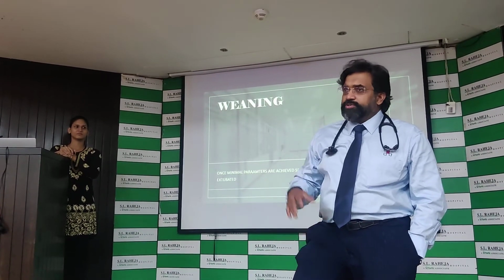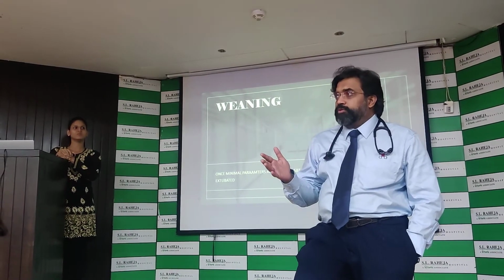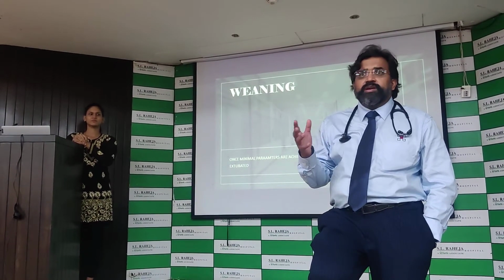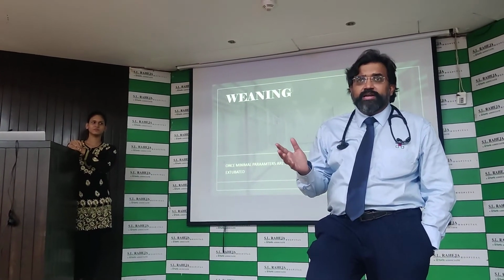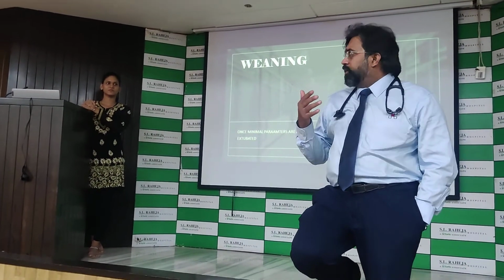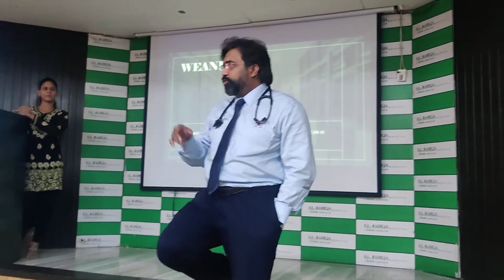To set the PEEP and the FiO2, this particular ventilator also has a PV curve, a PV tool. You can actually figure out what the optimal PEEP is. It doesn't have the FRC. Each of these ventilators has some yes, some no. But this has the PV loop. Sometime later, if that patient on top is still there, I can show you how to do the PV loop on that ventilator. Okay?